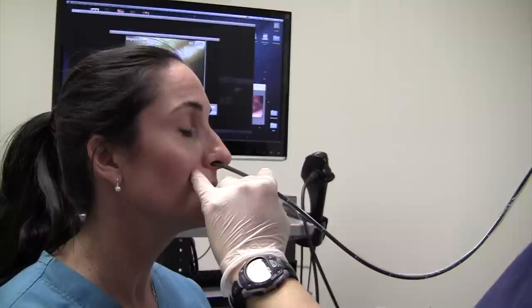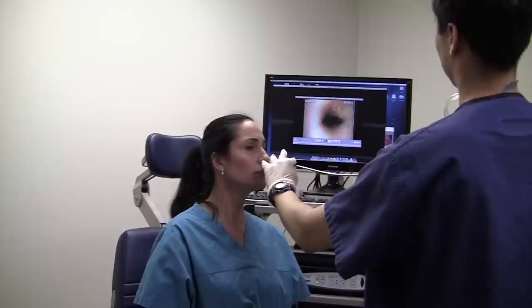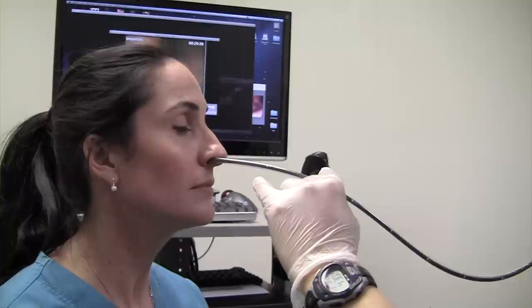As you can see, the patient is able to tolerate this exam without too much discomfort. Patients who are not candidates for awake esophagoscopy include those with a nose that is too small for the scope to enter, as well as patients with a very strong gag reflex.